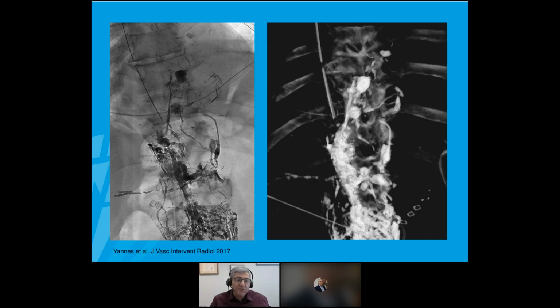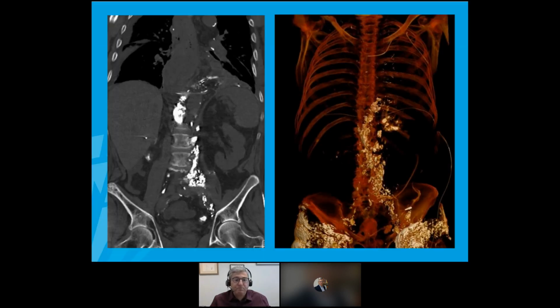What you can do then is to impregnate, infect all these collaterals with as much as possible of Lipiodol, so that you have a kind of saturation of these vessels, of these lymph vessels with Lipiodol. And this Lipiodol will not only show you the area of leakage, but will also have a kind of sclerosant and occlusive effect, and then it will also stop the leakage.